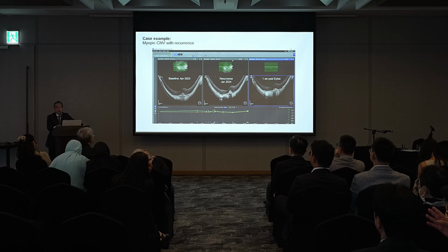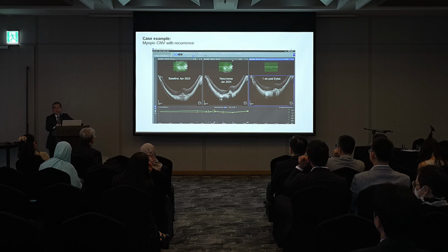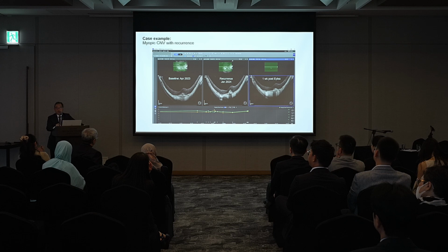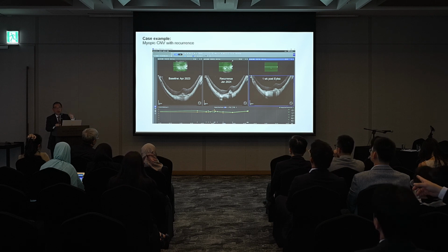With myopia, we've heard problems in glaucoma detection and diagnosis, but also actually in maculopathy. It's not easy to detect choroidal neovascularization, especially when they first appear. Patients may be symptomatic, but because they often don't present as hemorrhages until later on, or you don't see fluid like in typical AMD, we are really looking for fuzzy borders. And this is where the Forum and the Retina Workplace gives us very, very good inter-visit comparisons with accurate registrations.